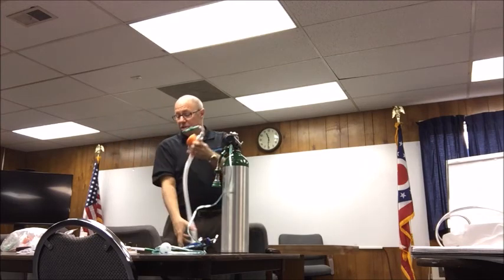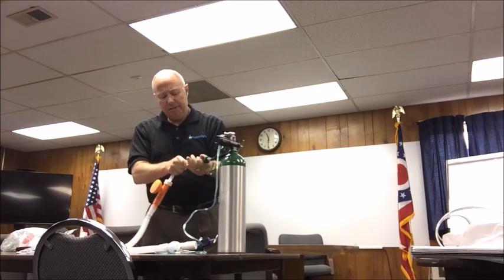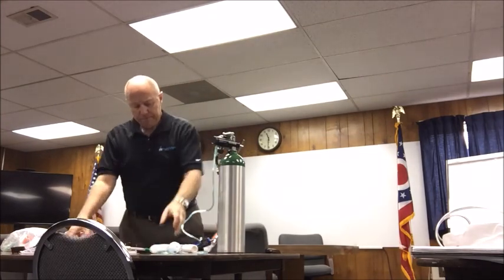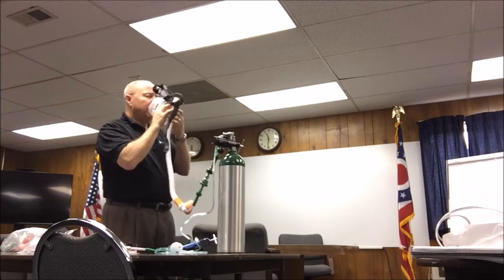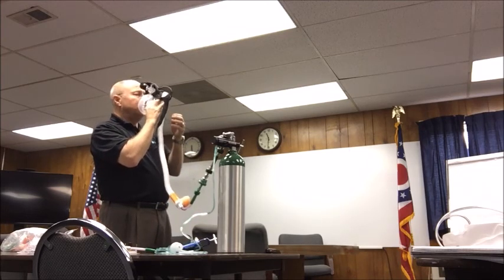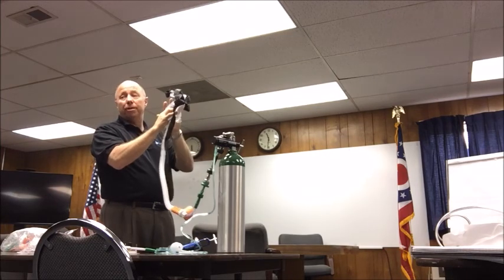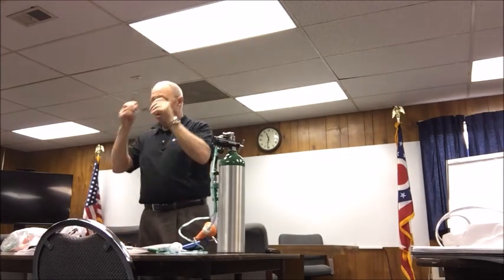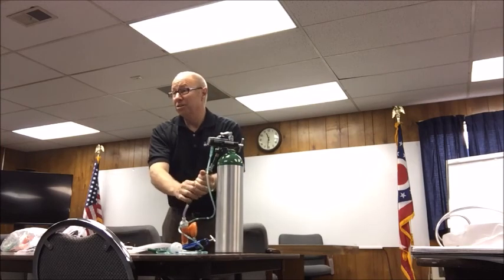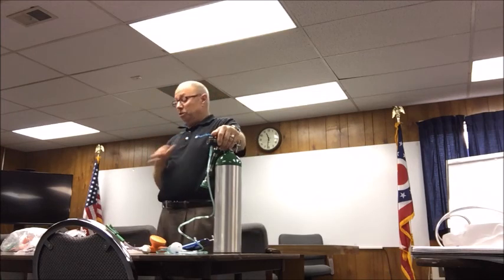Okay. I'm going to put this mask on. I'm going to show you what I mean when I say it kind of pressurizes against my face. See how it's flowing against my face? I don't have anything on this, and it's blowing against my face. I stress that a lot because I've dealt with a lot of people that have gone from the emergent to this, and I usually get called, oh, the mask is leaking, and the answer is loosen it, which is really a good thing.